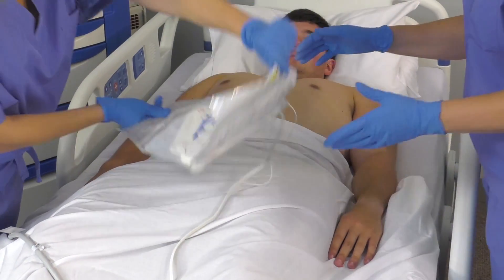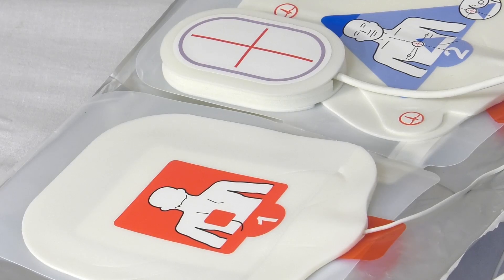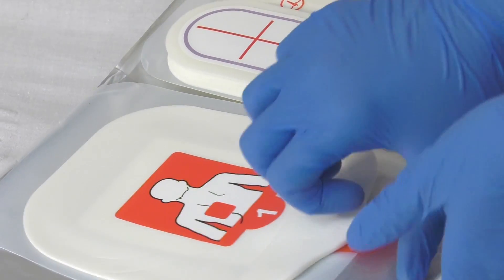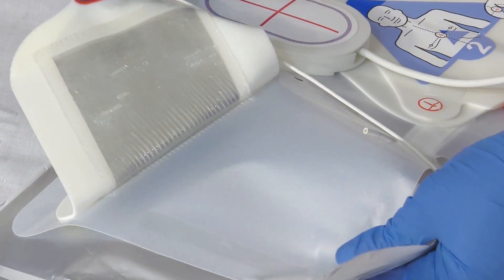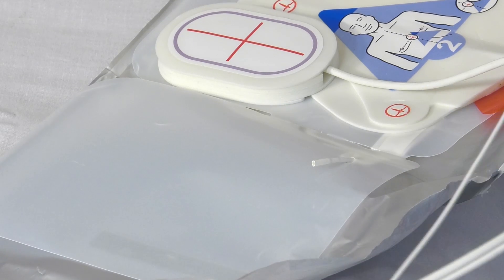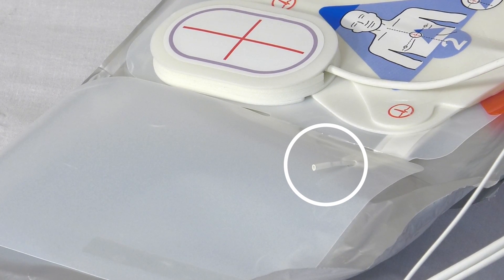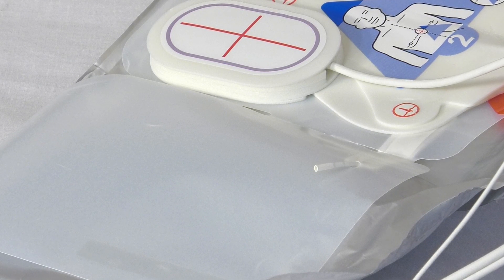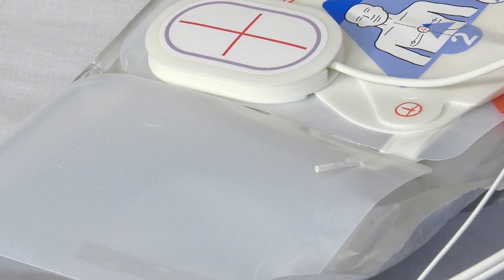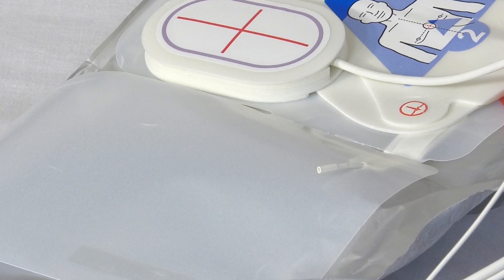To apply the one-step electrodes, place the back electrode first to prevent buckling of the front electrode. Grasp the rectangular red electrode labeled 1 and peel it from the plastic liner by lifting at the red tab at the base of the electrode. You may notice the self-test connector wire attached to the electrode packaging. This connector is used to verify the integrity of the electrodes and confirm their clinical readiness during the code readiness test.